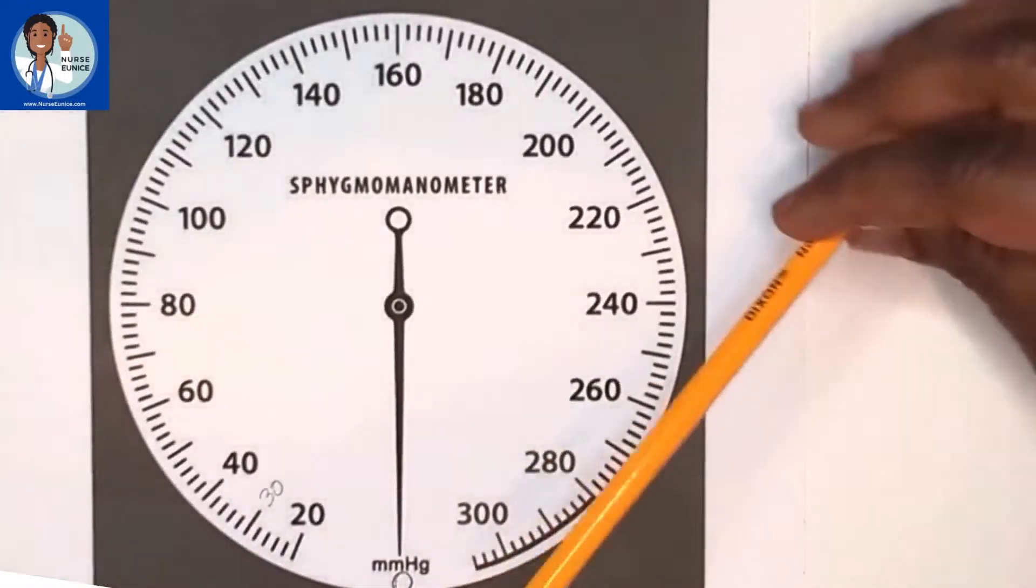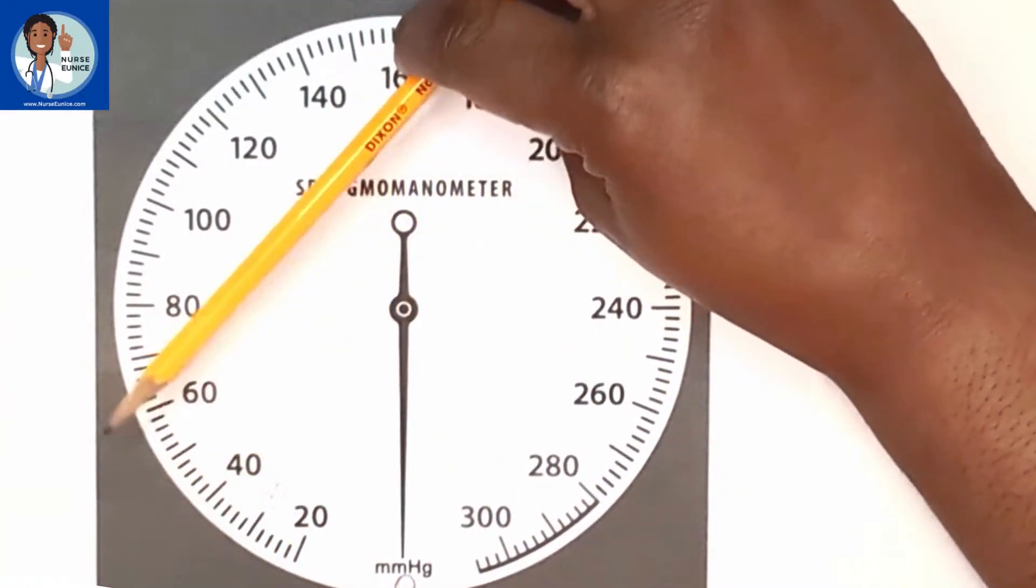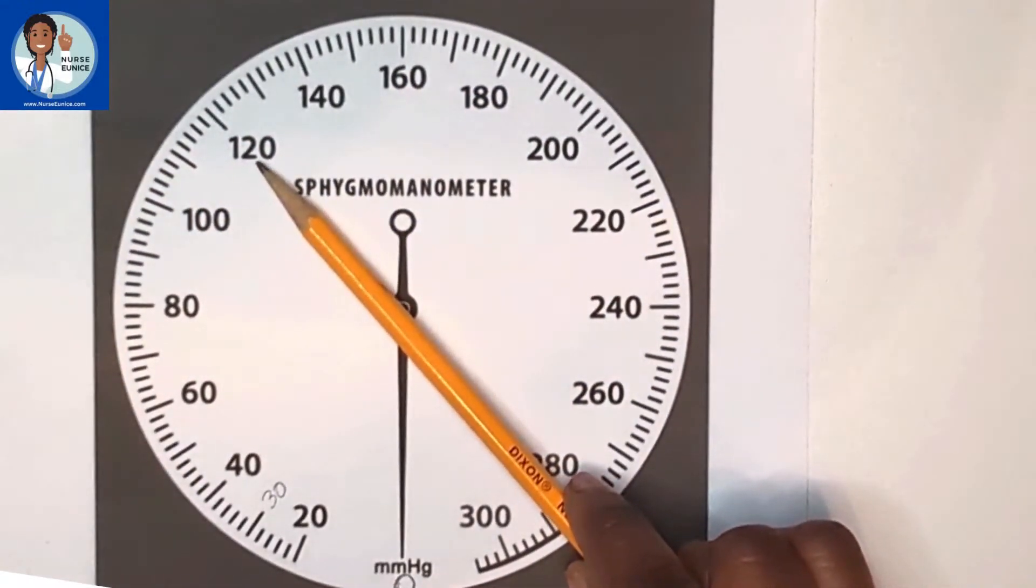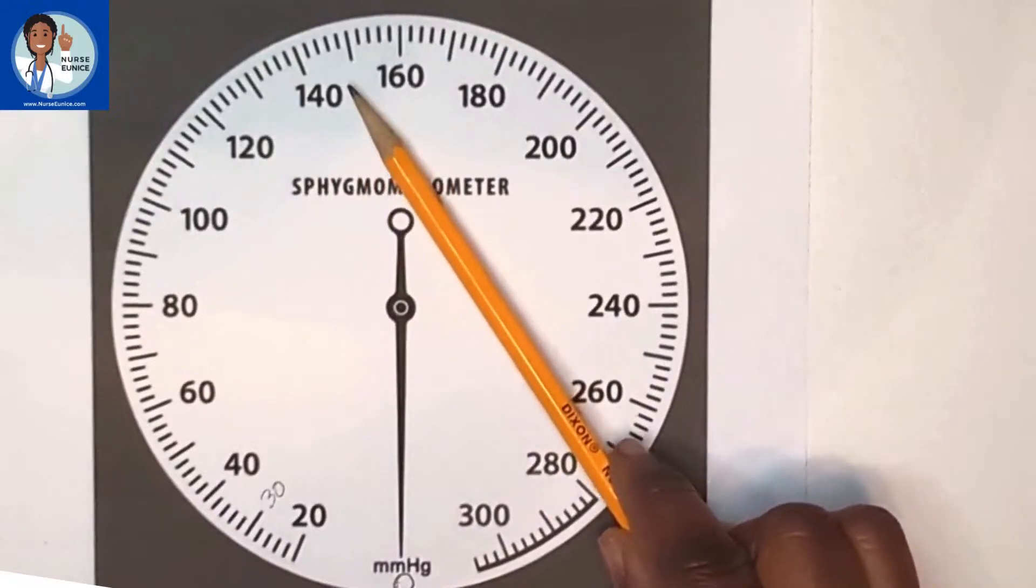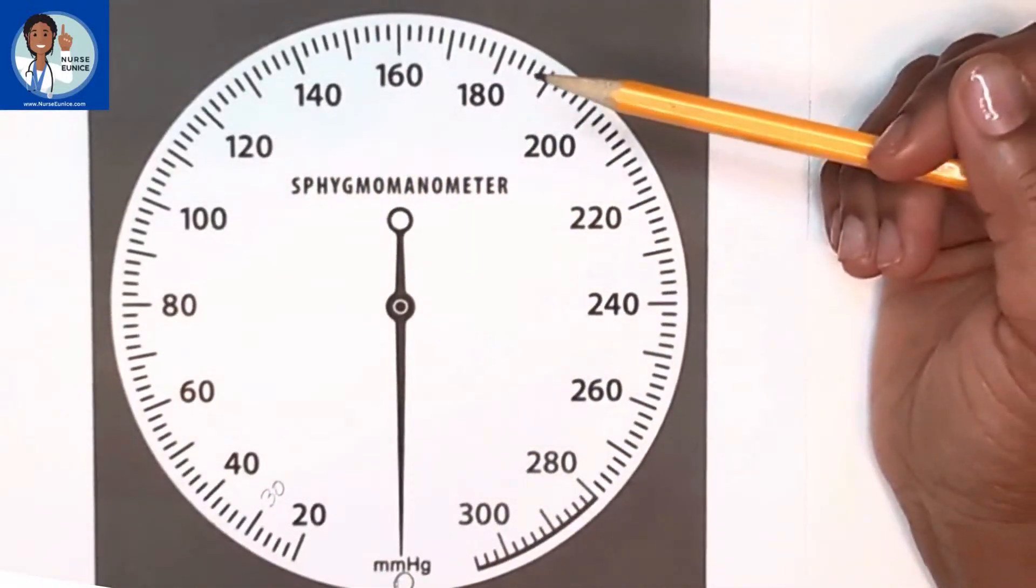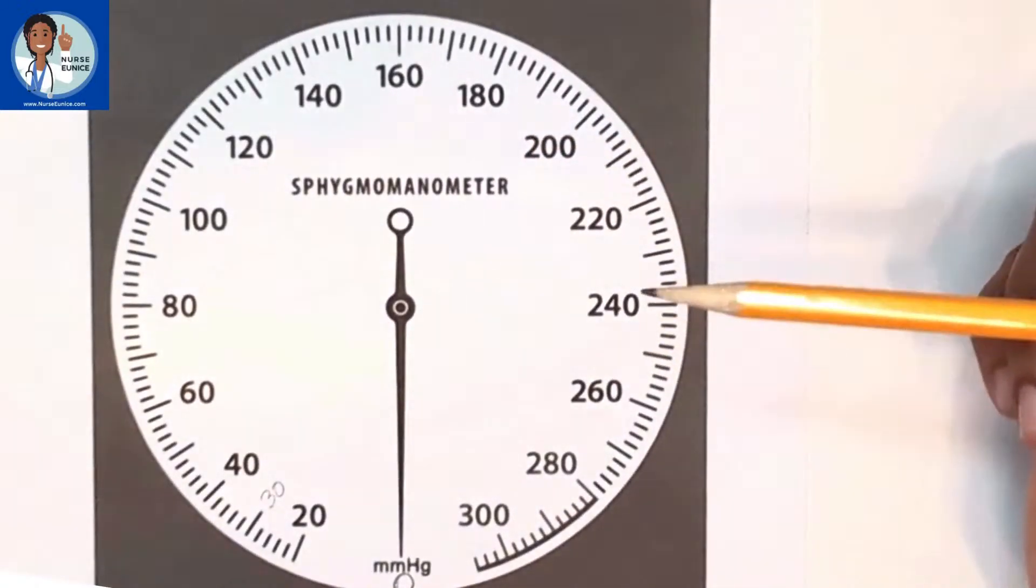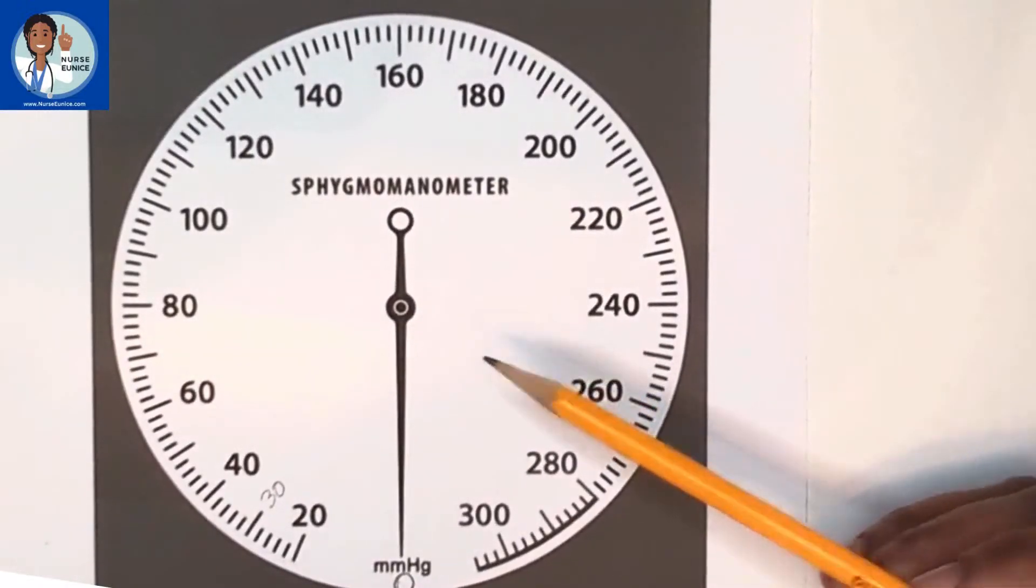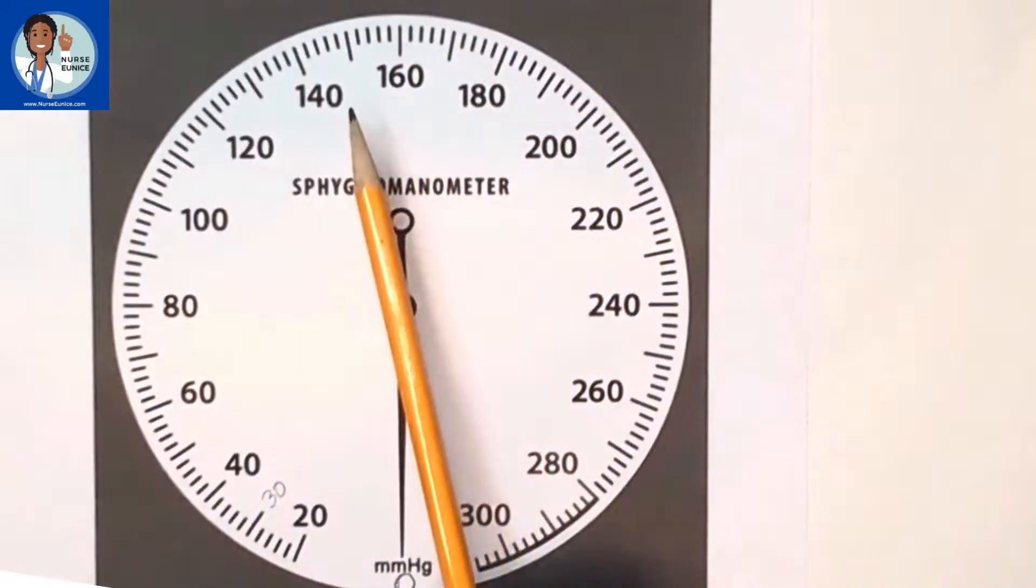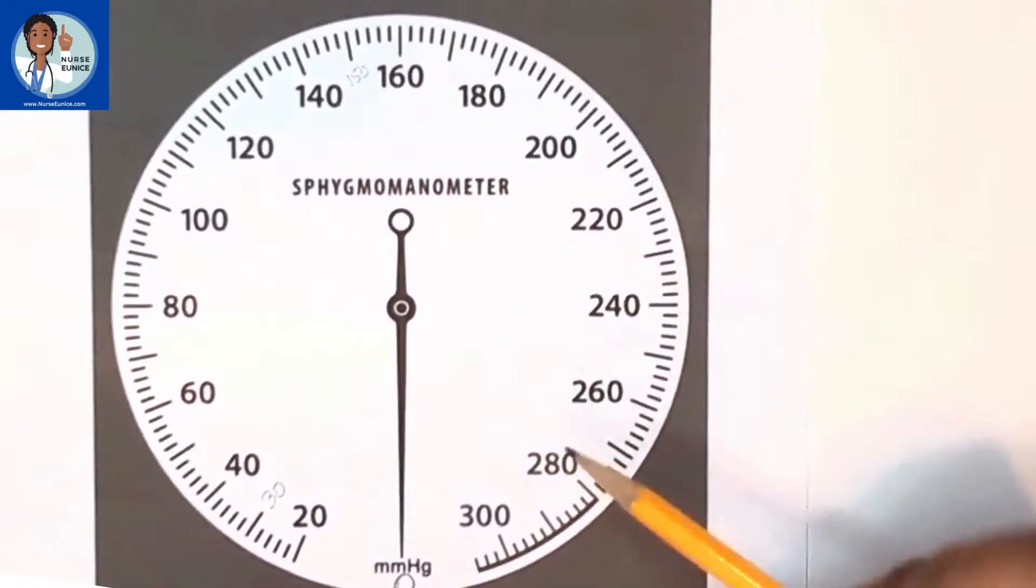Now I want you to pretend as if we are inflating the bulb. We're pumping. Our patient told us that their systolic blood pressure is normally 120, so we're just going to take it 30 above to 150. Now that's the cheat way. When you're in nursing school, they may teach you a little bit differently, but I'm going to show you the quickest way possible. You would actually inflate the pump to 150, and then you start.